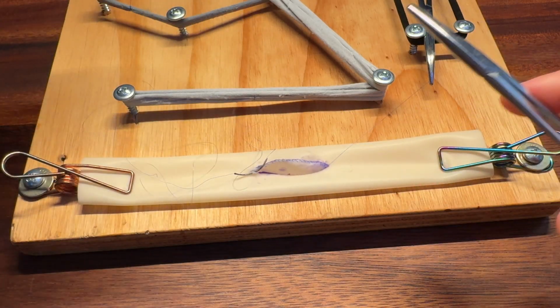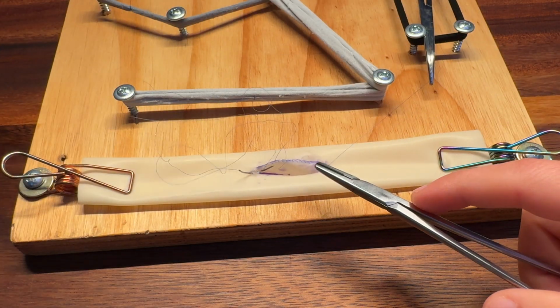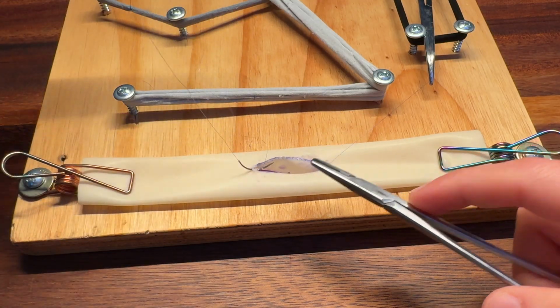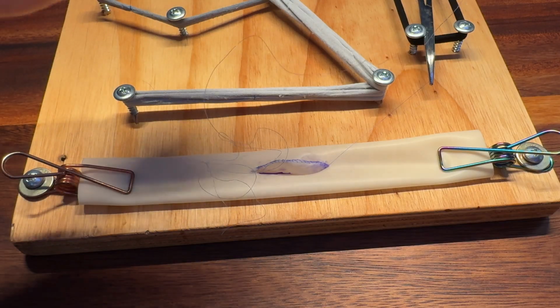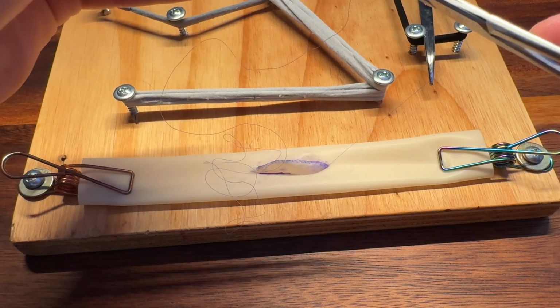So essentially, I don't want to cross my suture over, so I'm going to make it into a loop. Make sure nothing is touching. Make sure everything glides nice and easy.